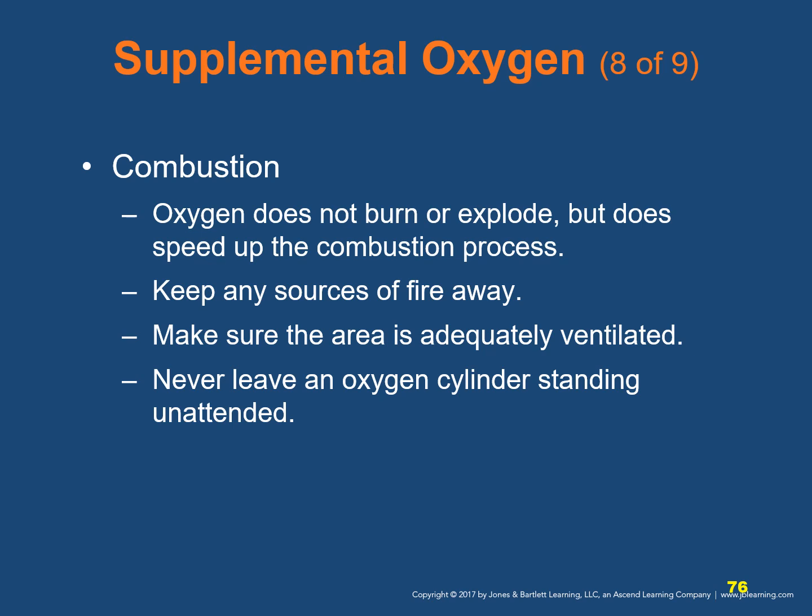So keep any possible source of fire away from the area while oxygen is in use. Make sure the area is adequately ventilated, especially in industrial settings. Sparks during vehicle extrication are a possible source of ignition, so that's one thing to carefully consider. Never leave an oxygen cylinder standing unattended. It can be knocked over, injuring a patient or damaging equipment, or it can snap off the stem at the neck and turn into a missile.